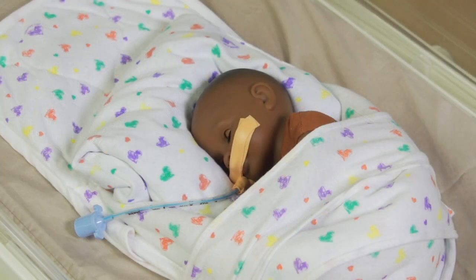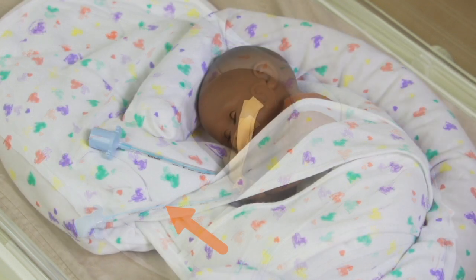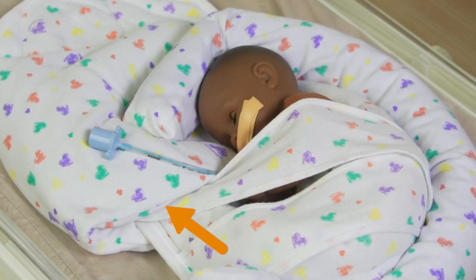For intubated patients, you can use a Frederick T. Frog to support head position. You can utilize the Frederick T. Frog as a place to rest the endotracheal tube to relieve tension from around the mouth, and you can add a bendy bumper to support the head position.